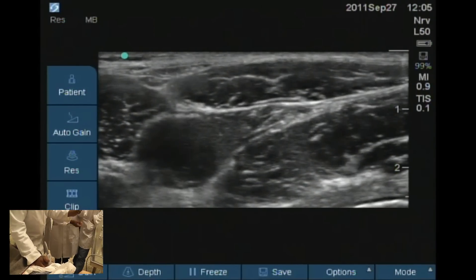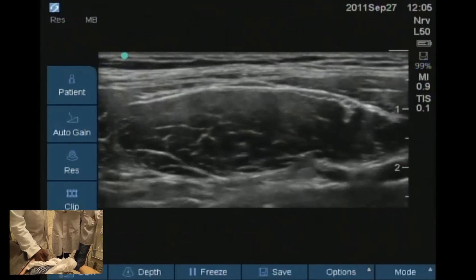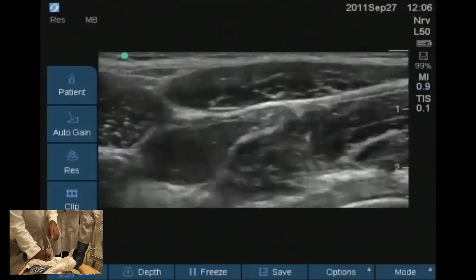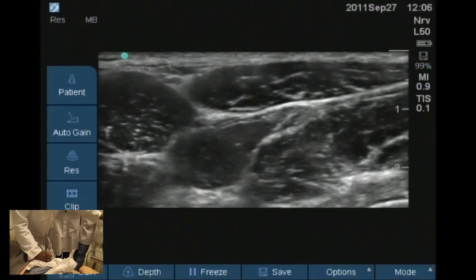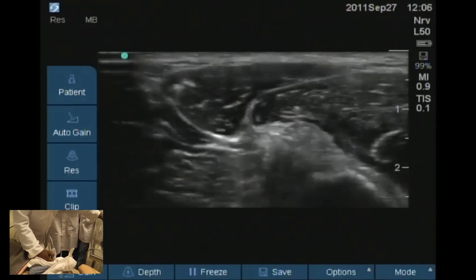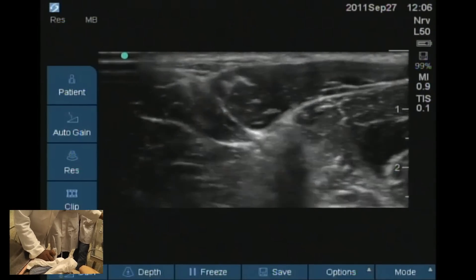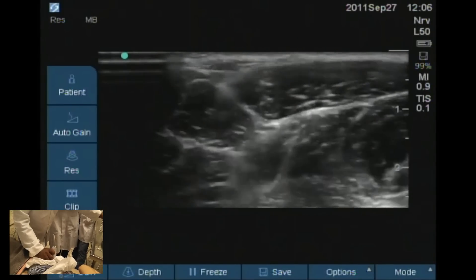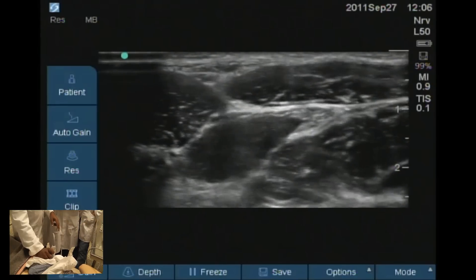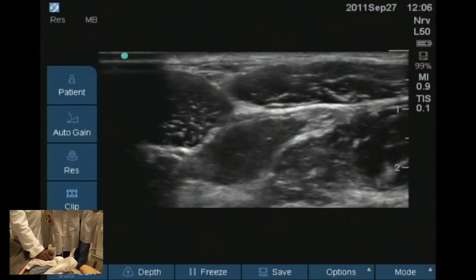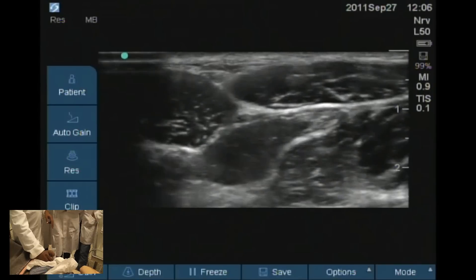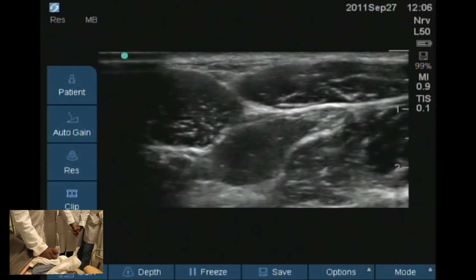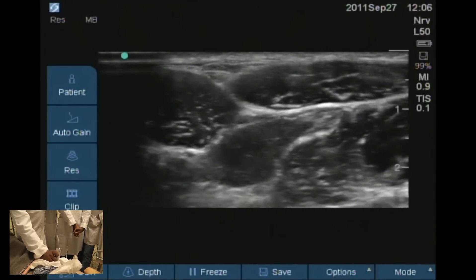That is your rectus femoris — the origin of the rectus femoris. As you go lower down it becomes bigger, because it is smaller there at its origin. You see that one? It is coming through the small tunnel. If you go higher up, keeping your probe still, you can see the lateral cutaneous nerve. This looks quite a good picture. Is it usually obvious like that? You mean the lateral cutaneous nerve? It is much more obvious — you can almost see quite distinctly white hyperechoic structure here.